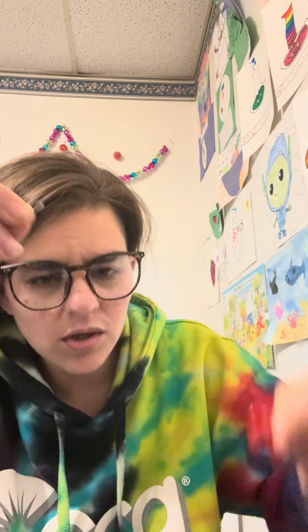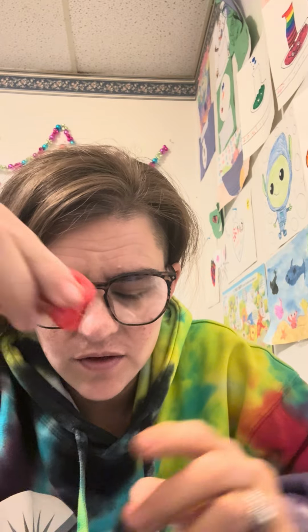My hearing aid goes on the other side, but it'll sit like this. So your string, you're going to bend it flat so it fits through the part that goes in your ear all the way to the other side. You don't have to use this tool, but it makes it so much easier to stick in if your hole is tight.